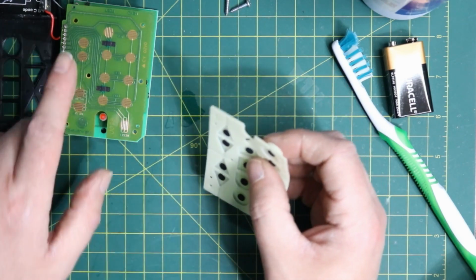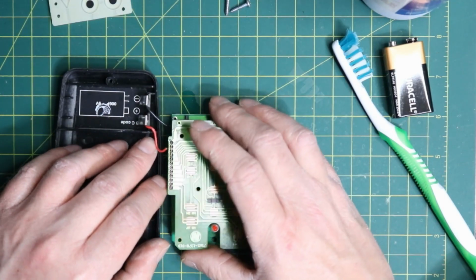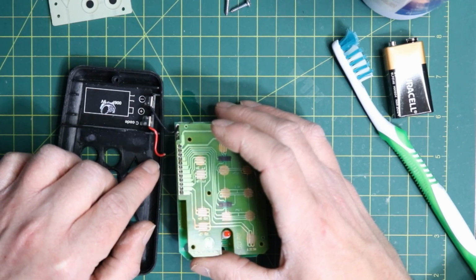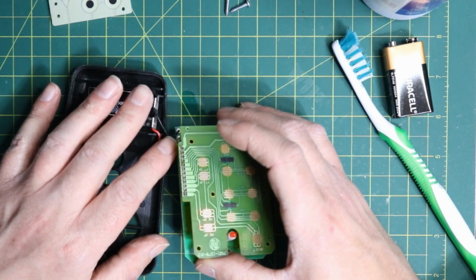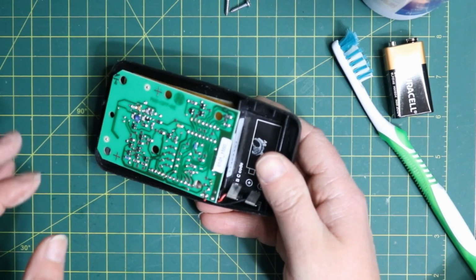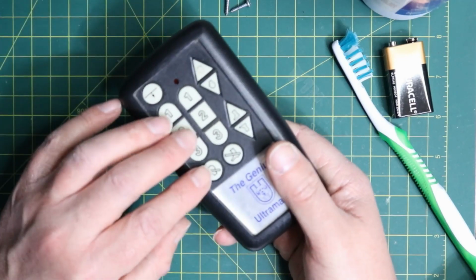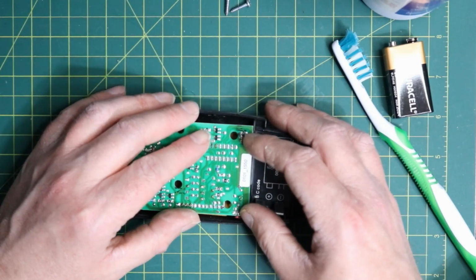There we go. So I'm going to go ahead and get this all soldered up now. Like I said, I'm going to solder it to the top side of the board there, the bottom side, I guess, not the inside. And I will call it good there. So now that we've got this all soldered up, I put the inlay in there, and we're just going to basically get it back together here now, and then we're going to call it good.